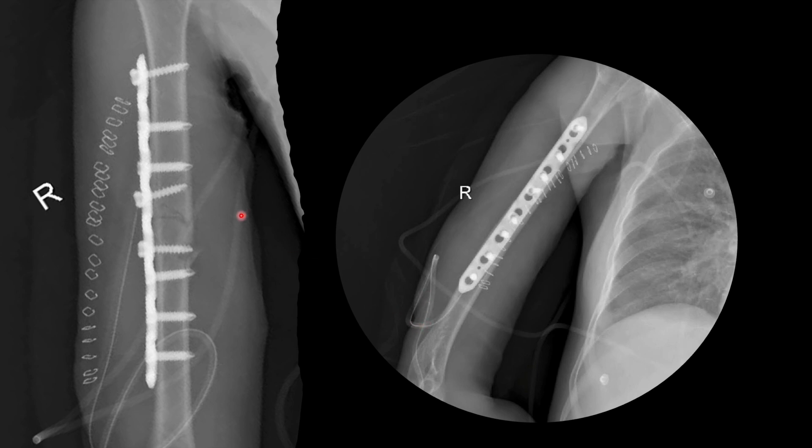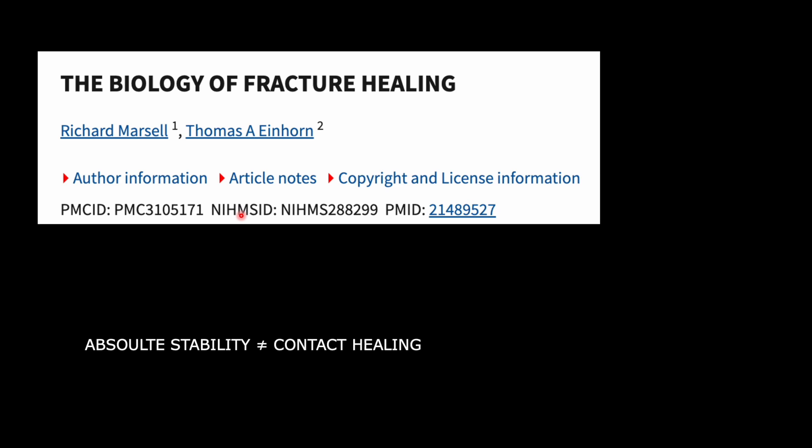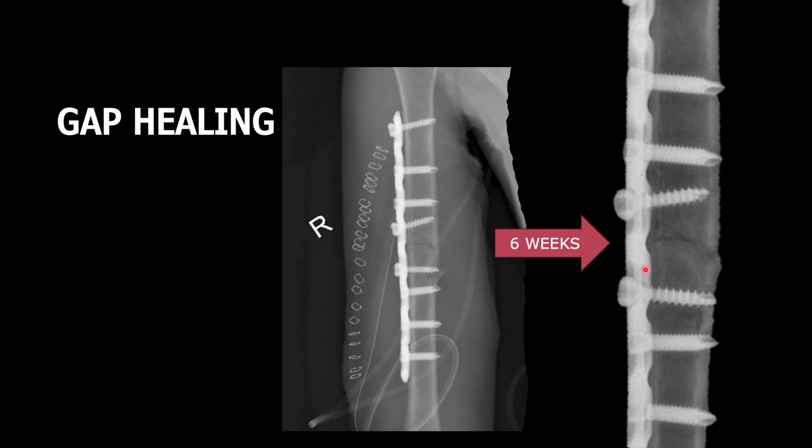The cortical screws are used as compression devices and locking screws as stabilization devices. Absolute stability does not always mean contact healing with cutting cones — there is also gap healing, which is part of absolute stability. After six weeks, the fracture line becomes more prominent in the follow-up radiograph. This is because in gap healing, new bone forms perpendicular to the axis of the bone at the surface of the fracture margins, causing sclerosis in follow-up radiographs.